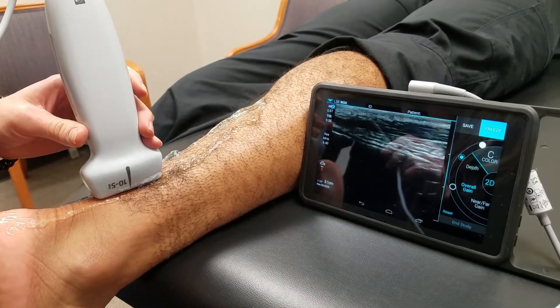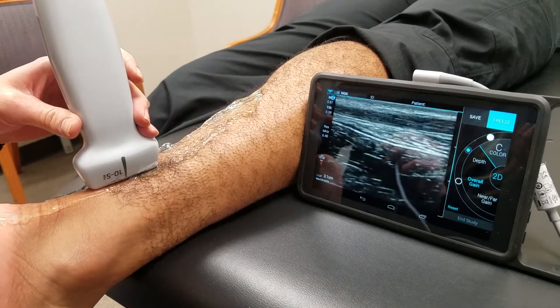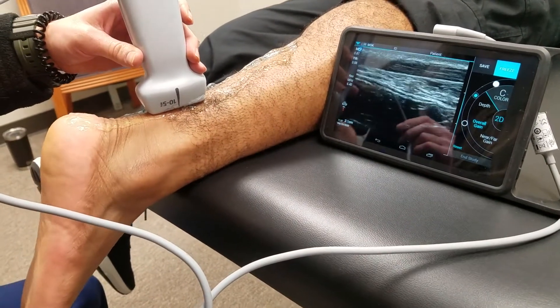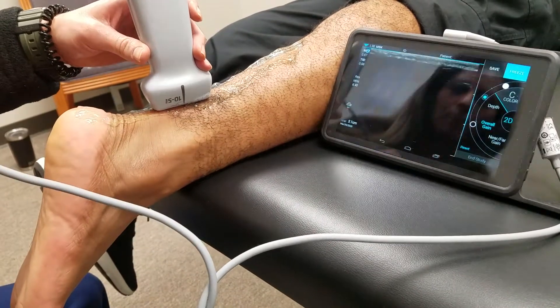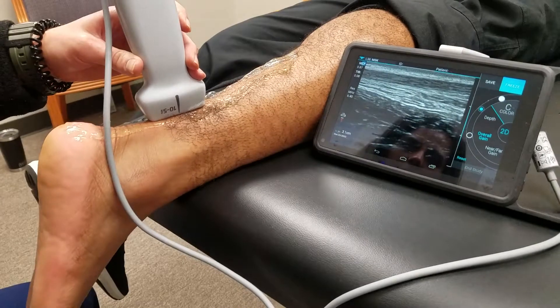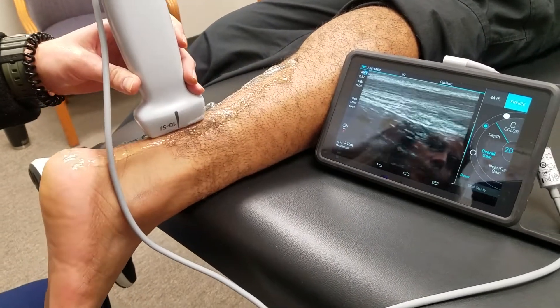What's really cool — Cornelius, go ahead and flex your toes back and forth. You see how everything is moving? That is good. We want that because he's using the muscle that pulls on that tendon to make it pull up as his muscle activates. And that's the Achilles tendon.